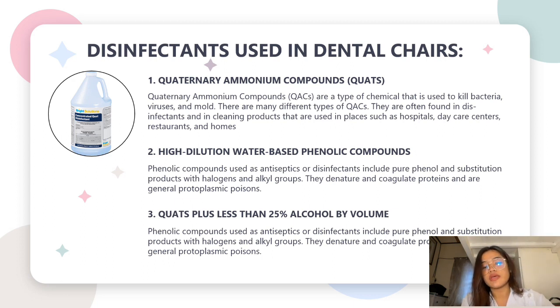Water-based formulation. So the high dilution indicates that these phenolic compounds are mixed or diluted with water to create a solution suitable for application. So the water serves as a carrier for the phenolic compounds. So, its antimicrobial efficacy. The phenolic compounds are effective against a broad spectrum of microorganisms, including bacteria, viruses, and fungi. They are often used in healthcare settings, laboratories, and industrial environments.